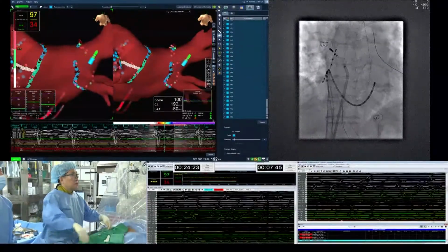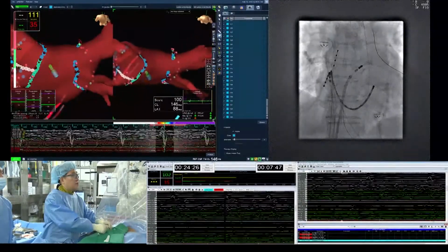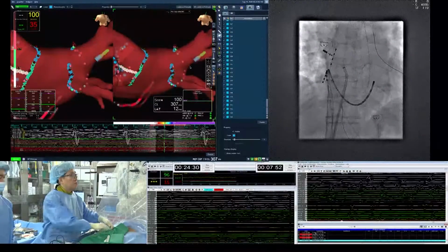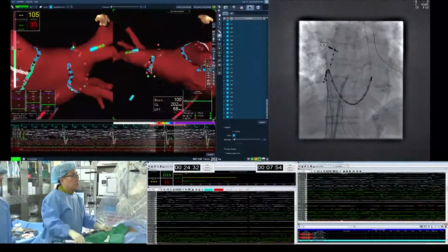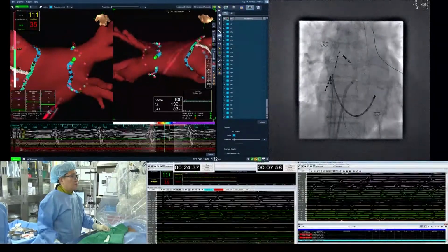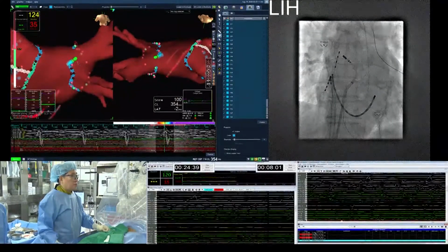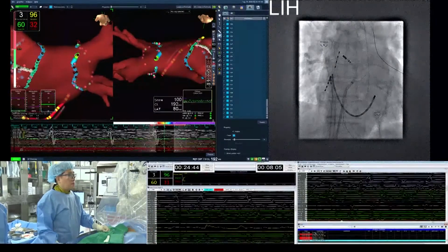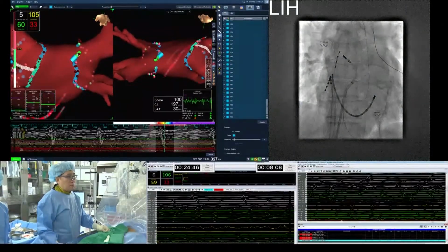And actually, the rooftop is here. This area is the rooftop of the right side pulmonary vein. So I push the catheter inside the pulmonary vein, curve down, and rotate the sheath to make this second curve, an S curve, then push the sheath gently, make a good contact, and fill up the roof side.